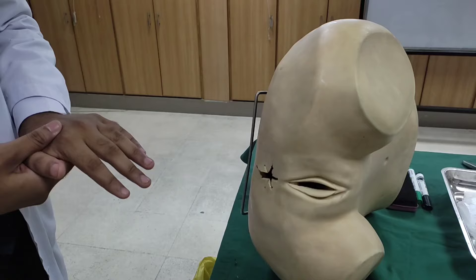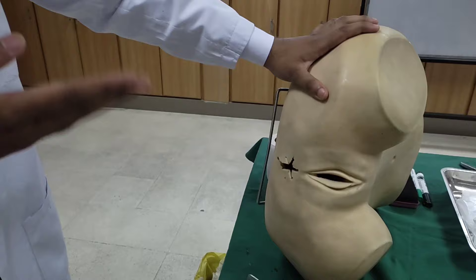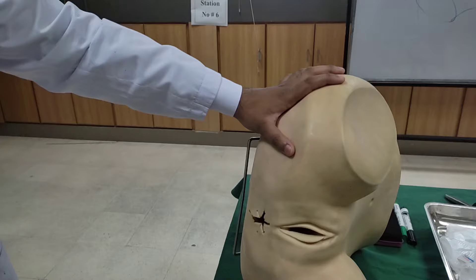Then we will do the inspection. Basically, we are going to do it properly. Both of the anal skin — we will separate them and we will see if there is a fistula, tags, or abscess. We will also check for fissures.